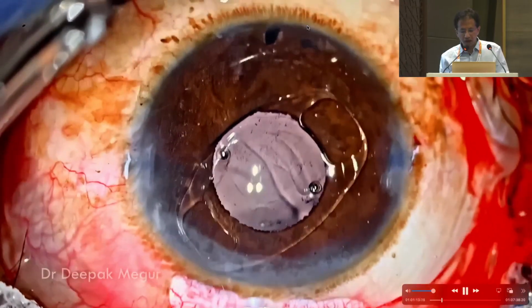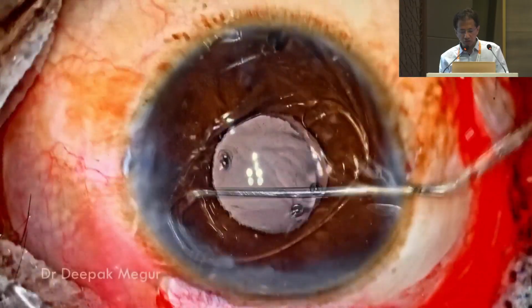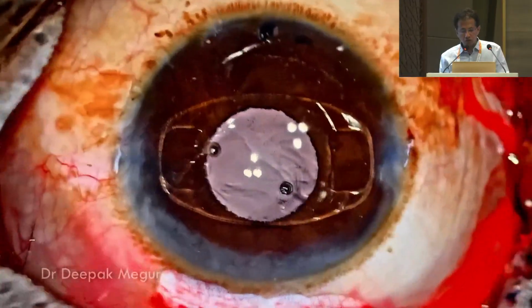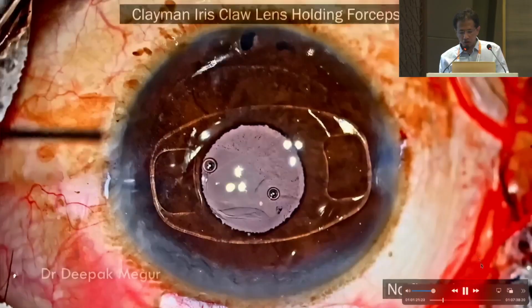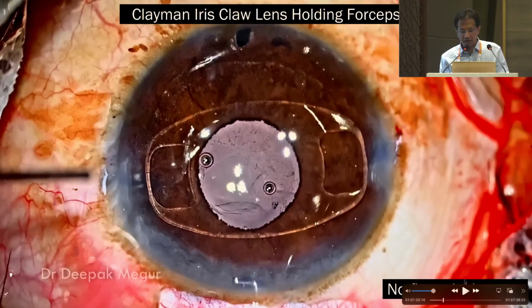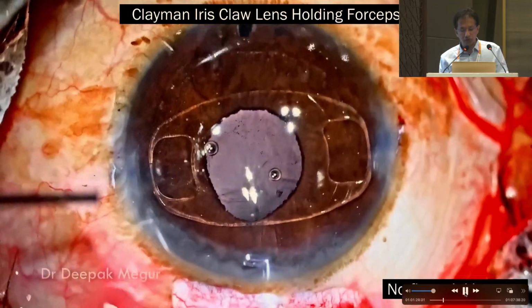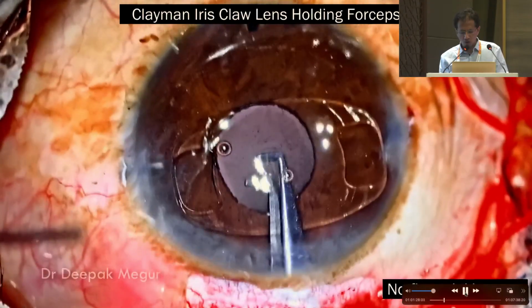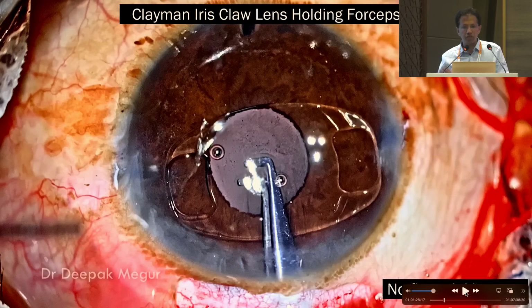So now the iris claw lens is being introduced into the eye. First we position it so that the notches are aligned at the side port incision which you have planned initially. The forceps which I prefer to use nowadays is the Clayman forceps. Actually, it has these small teeth. The advantage with this is its very thin profile.